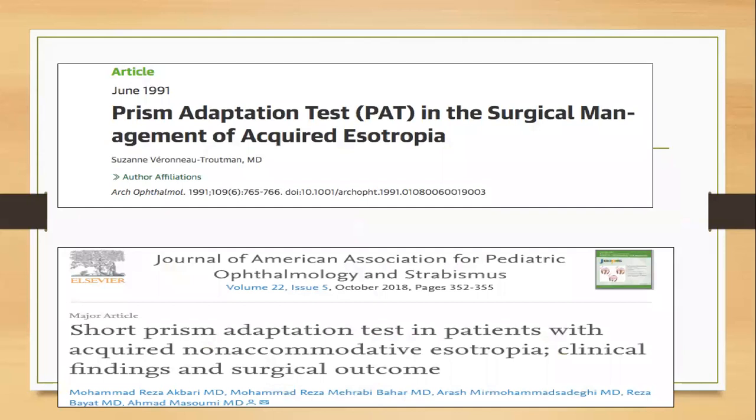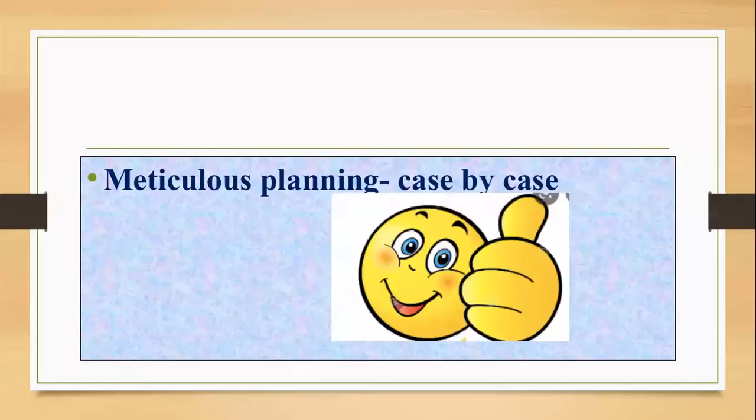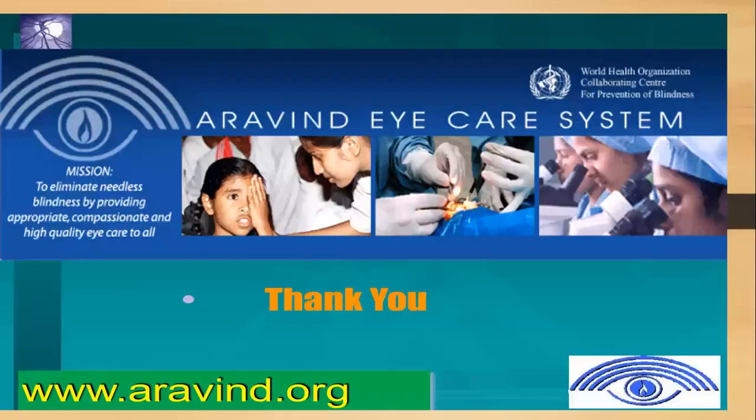There are various studies which show that PAT is used in the surgical management of acquired esotropia mainly and less commonly in IXT. Thus, PAT enhances surgical performance and success rate of strabismus surgery. This meticulous planning case by case can help in giving a good result. Thank you.